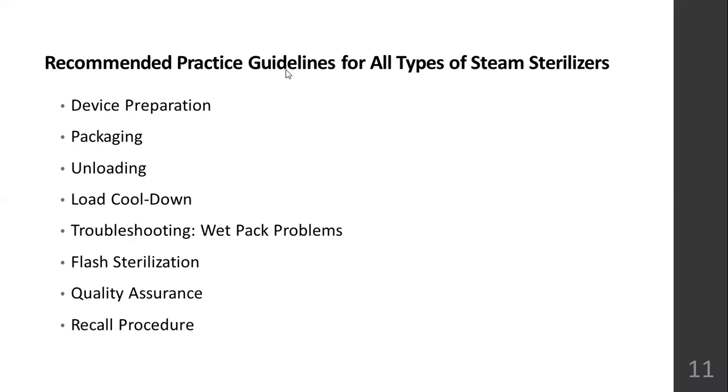They will find out the sterilization cycle of the particular date and they will send it back to the CSSD. And if there are any broken items or broken instruments, you have to send them for maintenance. You have to repair it, then do the sterilization, and then it should be sent to the user departments for use. So these are the basic guidelines.